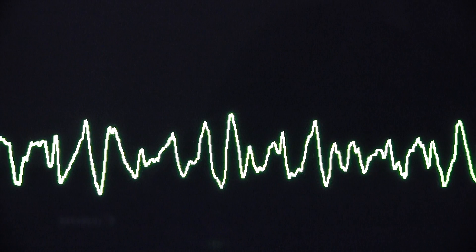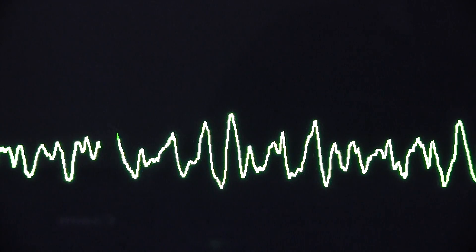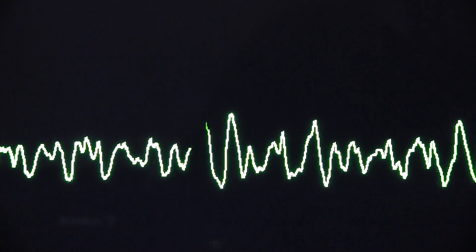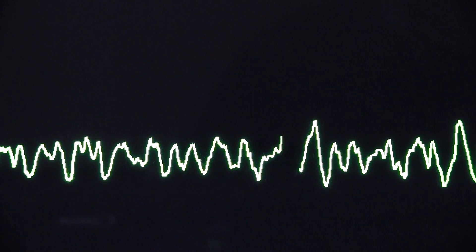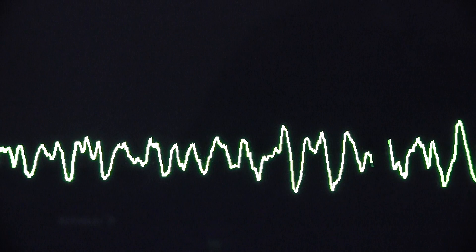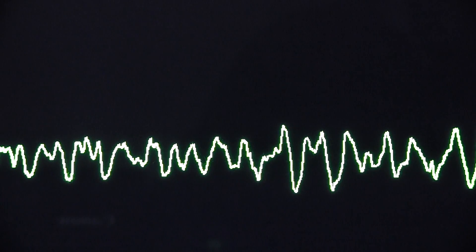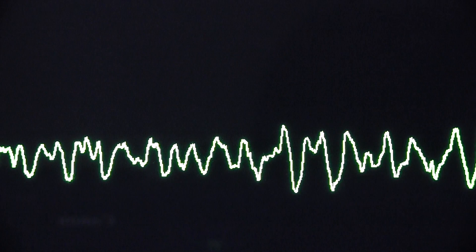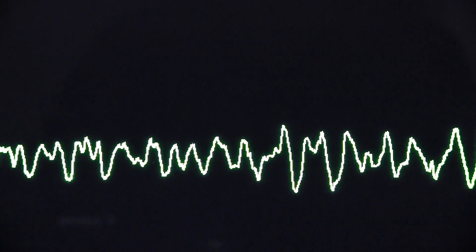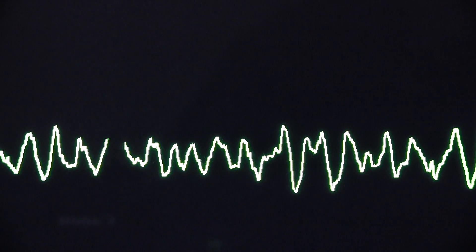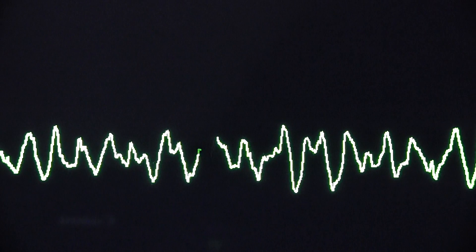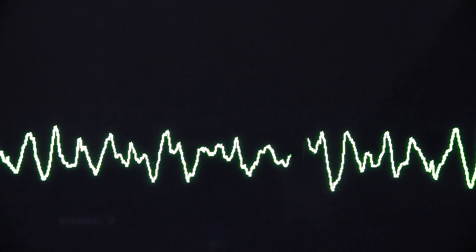And we notice the rhythm's irregular with poorly formed wide QRS complexes. And I would certainly classify this as a coarse ventricular fibrillation. But because we're not treating it, it will become finer over time. We'll get a finer ventricular fibrillation.